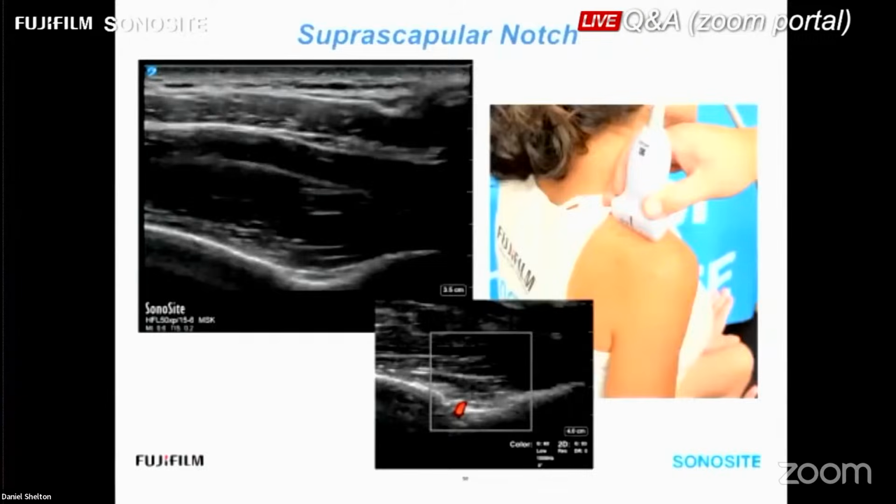You can do therapeutic injections, or you can do diagnostic injections at this level. So this can be a part of your shoulder diagnosis, while not in a rotator cuff protocol manner, in an ultrasound guided needle injection around this nerve to see if that patient's pain generators go away just by isolating that suprascapular nerve. So this can be a great tool to pull out of your toolbox if you have other options.